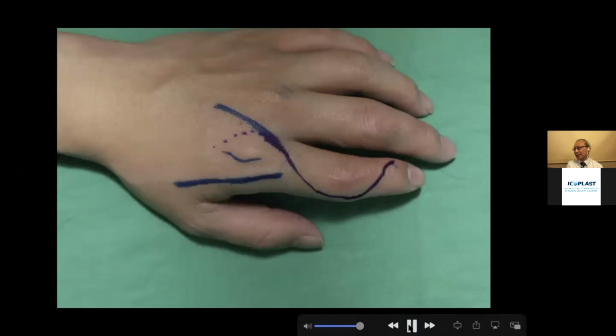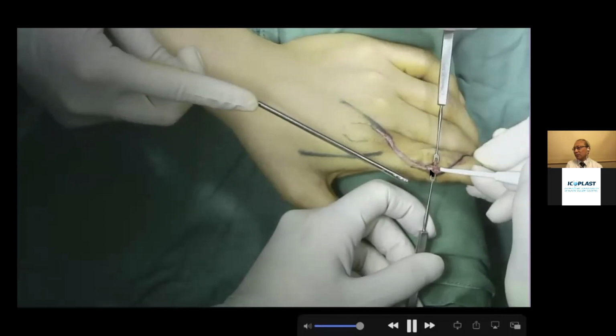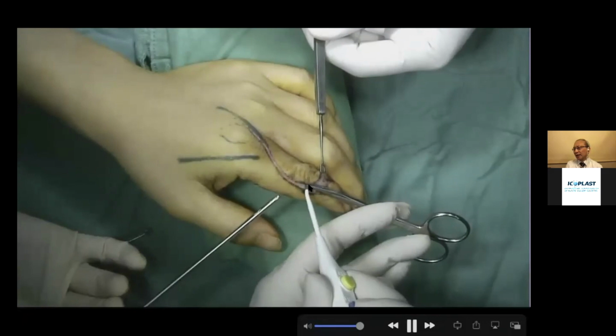Okay, so starting from the skin incision. So, a curvilinear incision. And because the PIP joint was the most injured part, there are more scars here, so try not to start our dissection from here. I approach from where there is less injury, such as the middle phalanx, then follow the extensor tendon and try to go through a single plane.